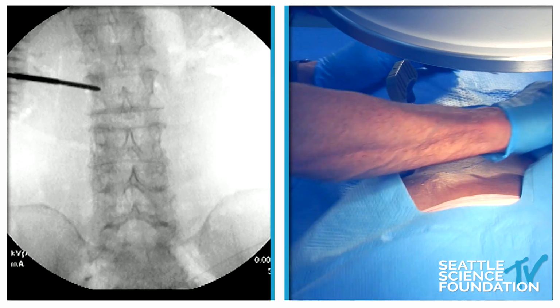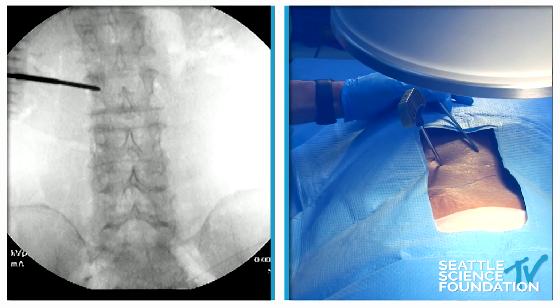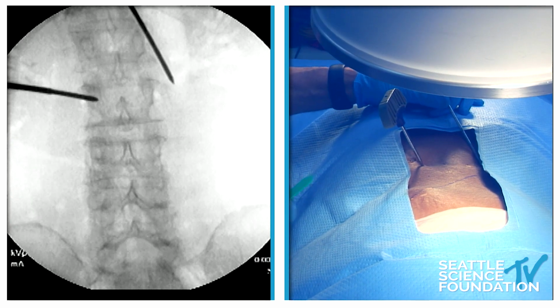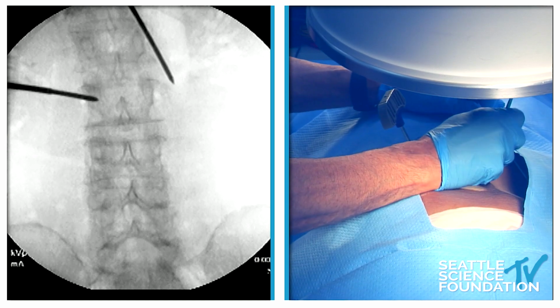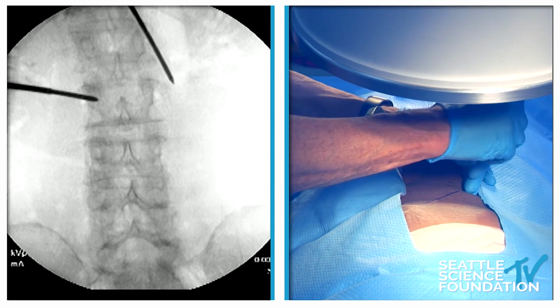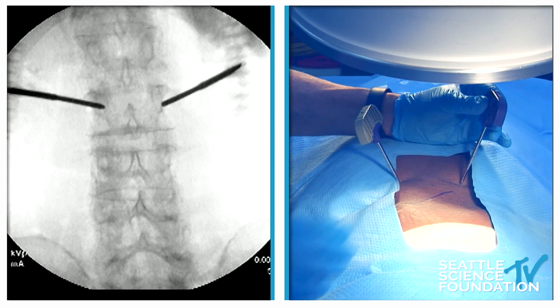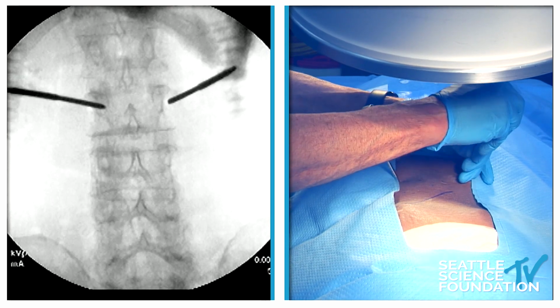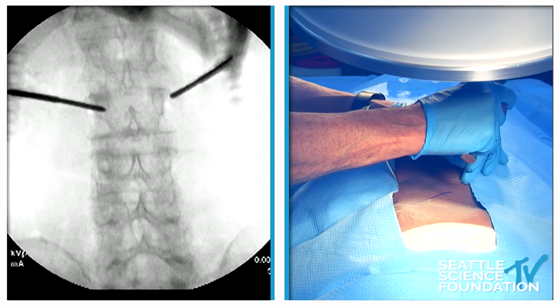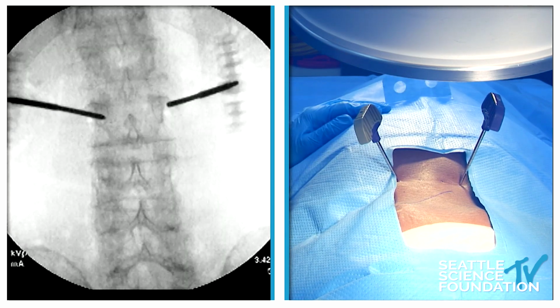And we'll go centimeter up, 2 centimeters out from the opposite pedicle. On this one, we'll start at the 2 o'clock position, and we'll go a little farther out than that. Our start point will be about right there. And we'll start on the other side. What we're going to do is drill, and then after this, we're going to balloon. Probably we should have the cement mixed or in the process of mixing, because it won't take us very long to get there.